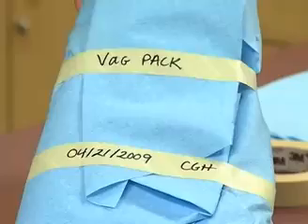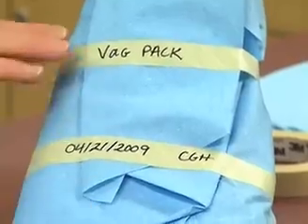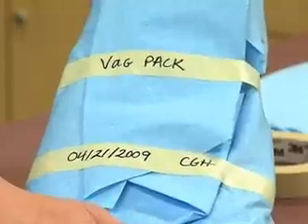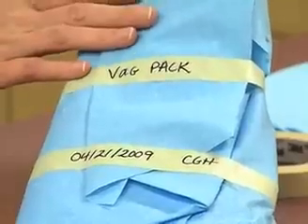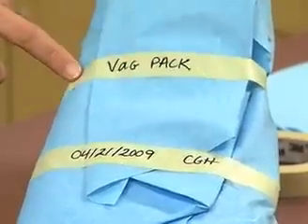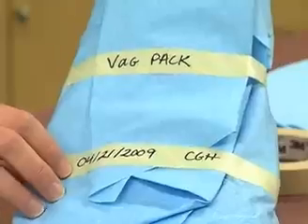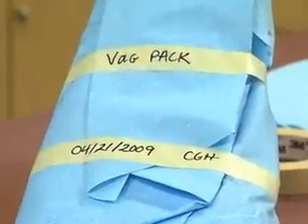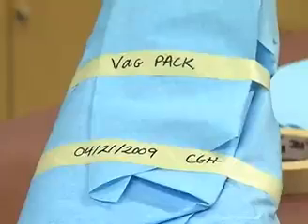Before we put it into an autoclave, we want to make sure that it's always labeled. In our office, we use an abbreviation for all the contents of what is inside — we call it a vag pack. Other offices may list every object found inside the wrapping. We also need to include the date that we're going to be autoclaving it, and we need to include our initials so people know who put this together — just in case any changes need to be made to the procedure later.